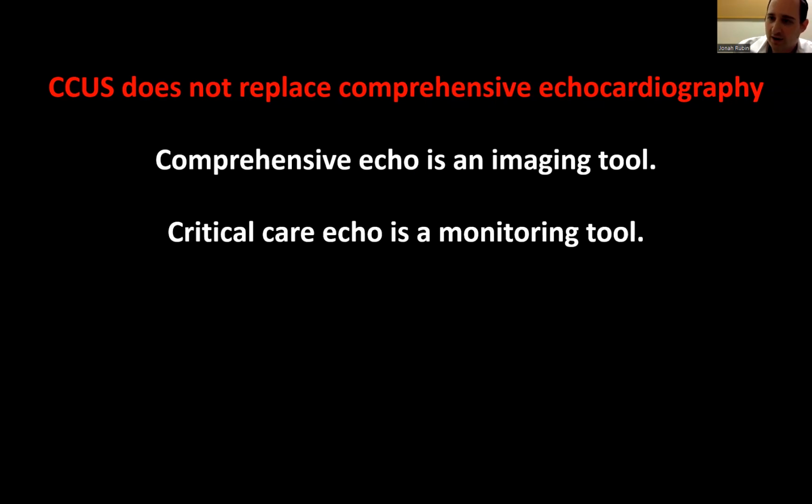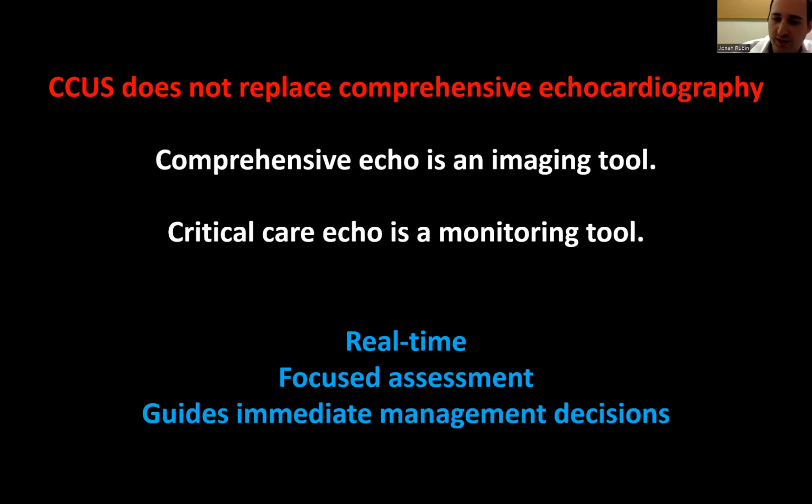But a critical care echo is a monitoring tool, right? It's not as refined. It's not going to give you as much detail. It's not as high res, so to speak, but it's something that you can use in real time to make a very focused assessment for your specific patient. It guides your immediate management decisions, and it can be reassessed. So it's not a continuous monitoring tool, it's an intermittent monitoring tool.